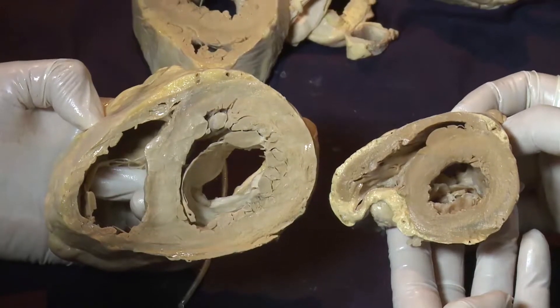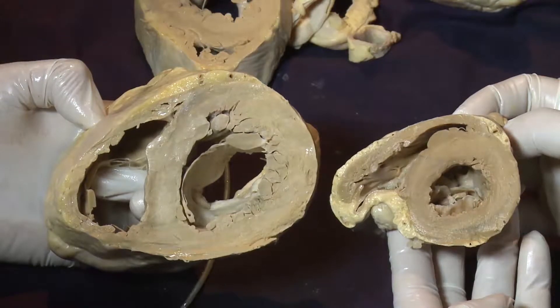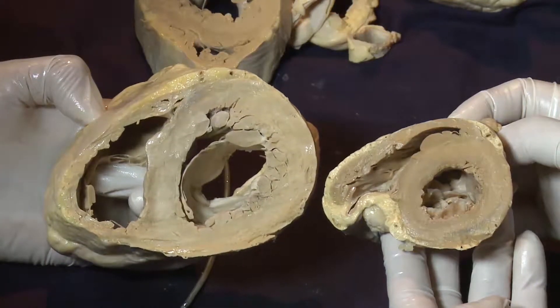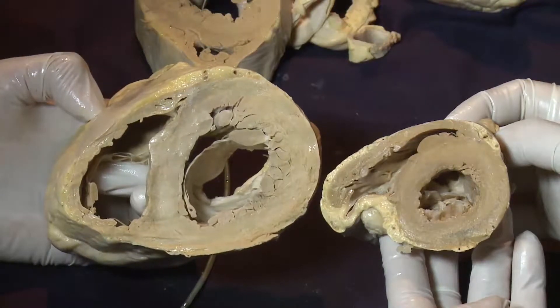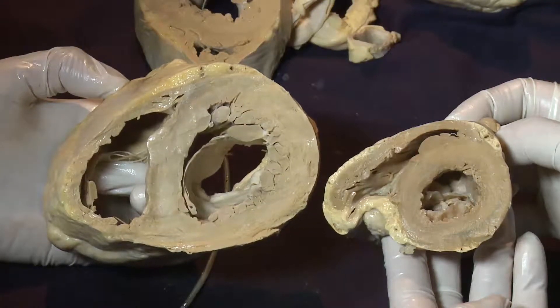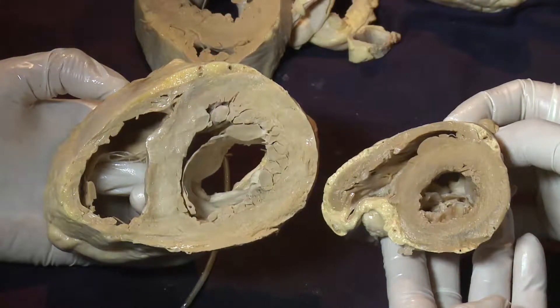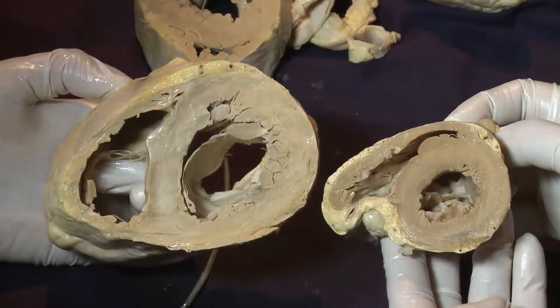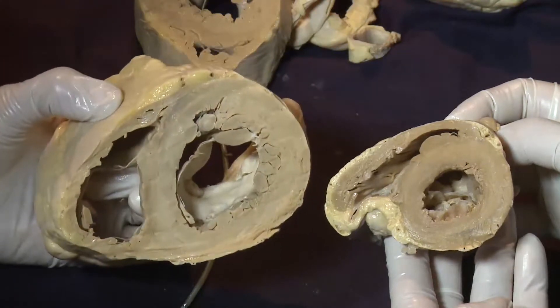One comment: if Dr. Chi is still here, I'm curious about the management of the donor heart — what the preference is in Korea for preservation solution. I would also comment that in the video, we often do warm reperfusion through a leukocyte filter prior to unclamping the heart, and we think there are certain advantages in doing that if they ever consider incorporating it into their procedure.